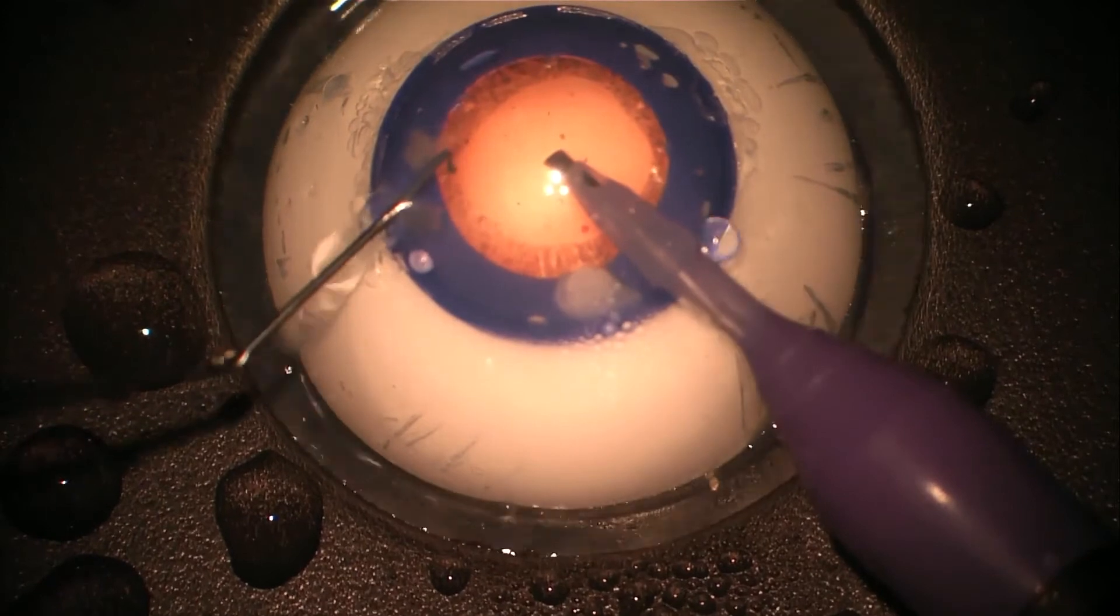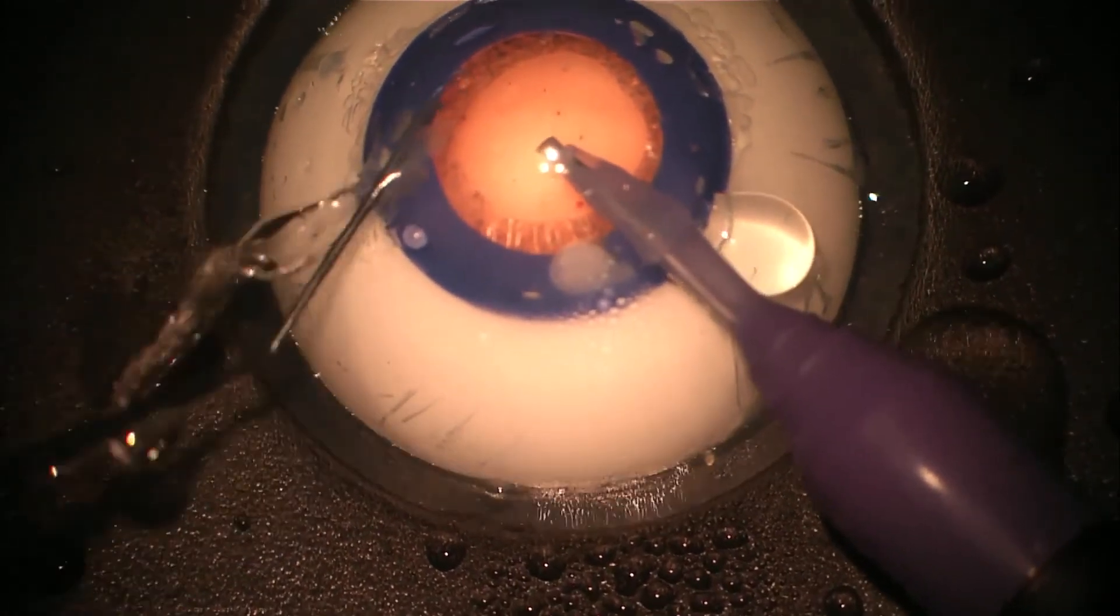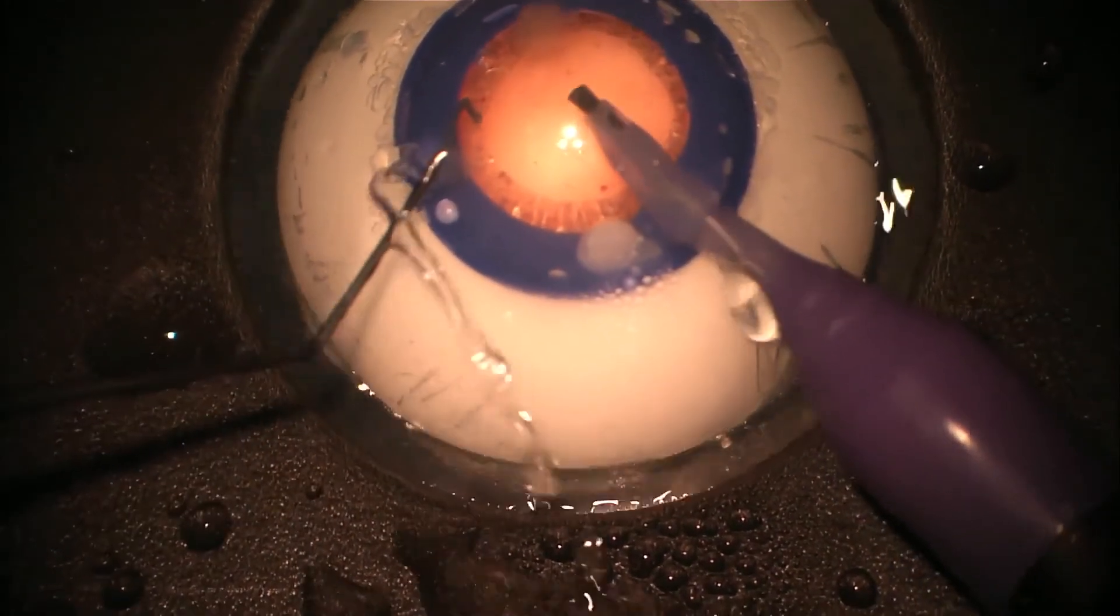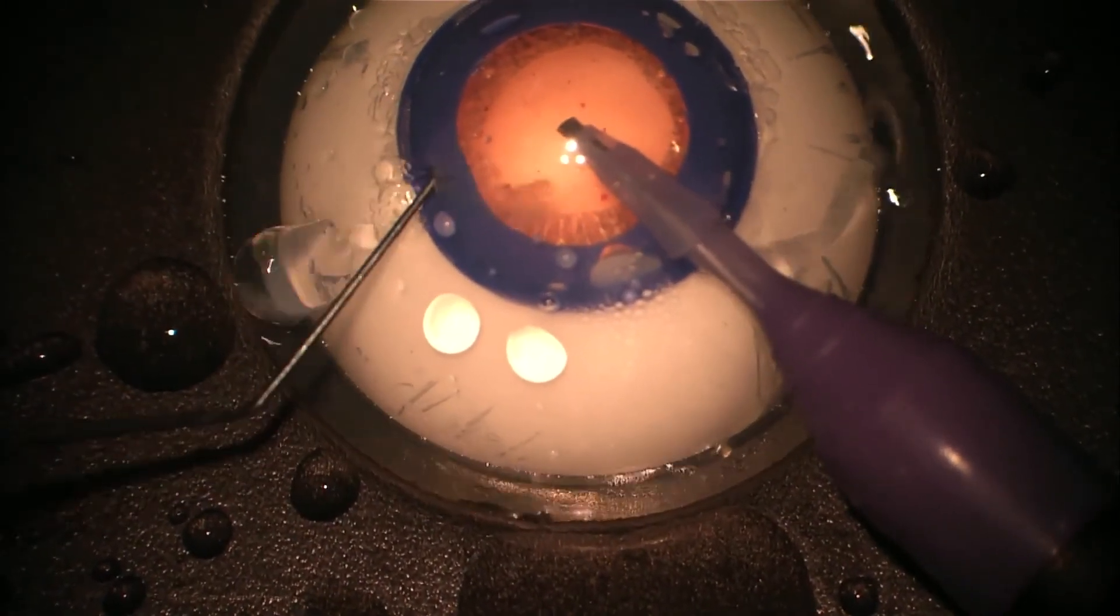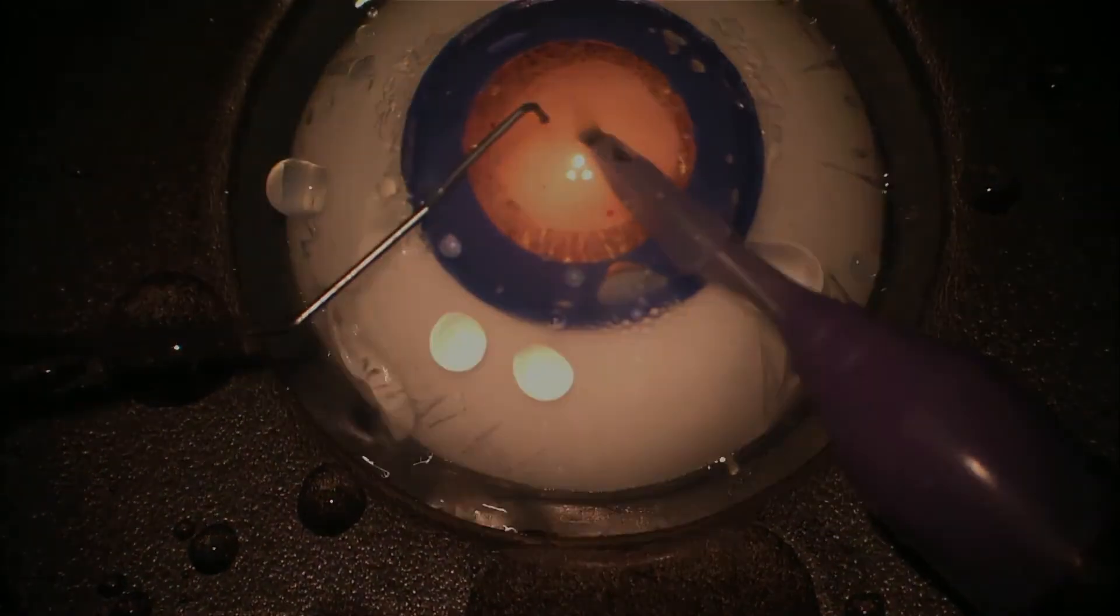In the last couple of seconds of the clip you can just see the little small remnants of the lens which in real life surgery can be a little bit tricky to maneuver and to remove, and the last one just disappearing now up the port.